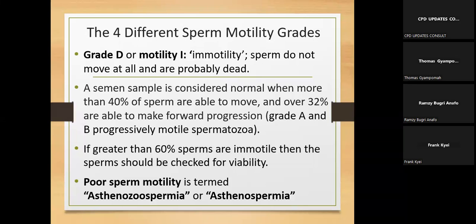So that will bring in the concept of viability. So you can have immotility where they are not dead, yet they are not showing any kind of movement.